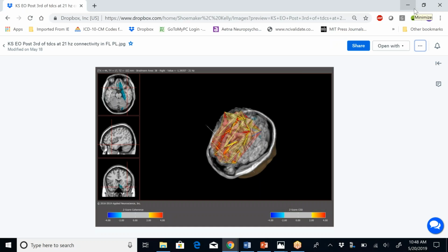So anyway, those are the typical ones. tDCS, and what's called tACS, transcranial alternating current stimulation, which has another dimension, and traditionally that's been used a lot in neuropsychiatric disorders, in particular overarousal disorders, but is now being applied more to cognitive disorders. That's a very, very new area of research.